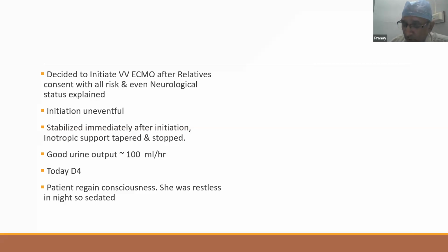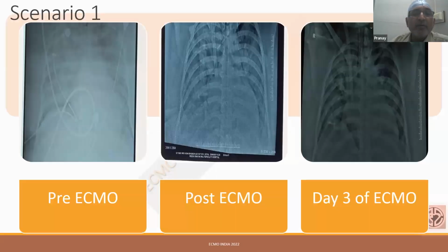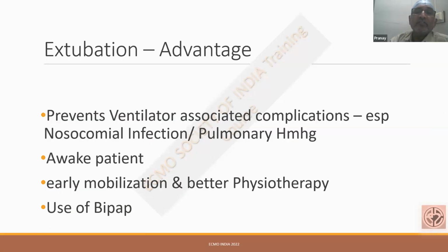We got the CO2 down gradually over 3 to 4 days, and after 4 days the patient became fully conscious and was obeying commands. You can see the X-rays have improved. Okay. She was obeying commands, so this patient was then considered for awake ECMO.